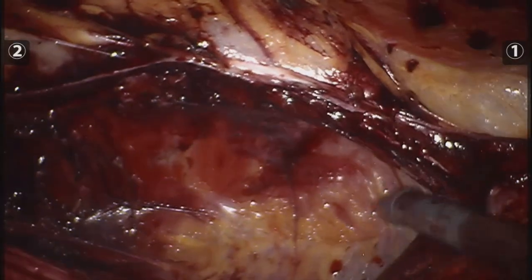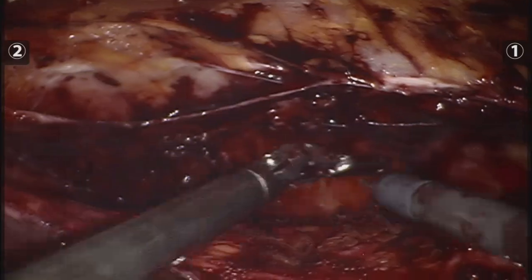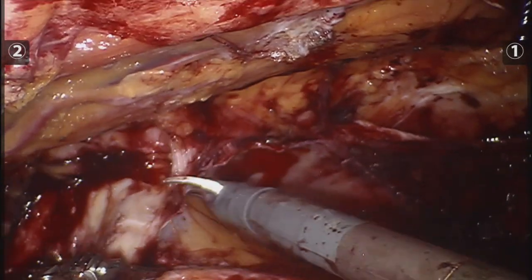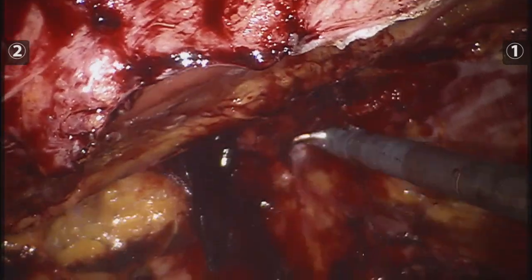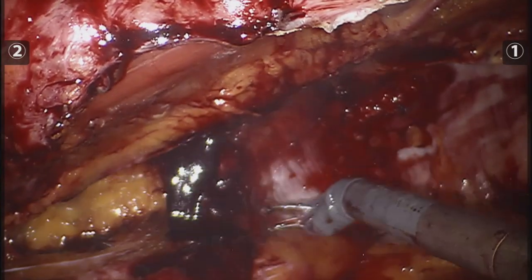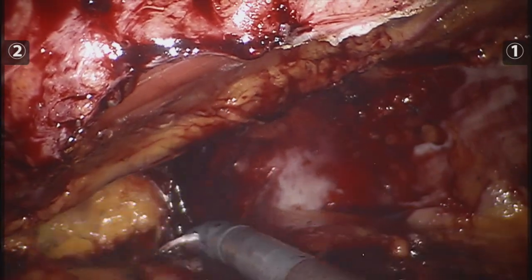I had to keep coming back to places where I had already done my dissection because I didn't go deep enough to make my transversus lay nice and flat on top of the viscera. But as the case progressed I was able to release the transversus, get access to the retrorectus space, and finally finish the release on the right side.